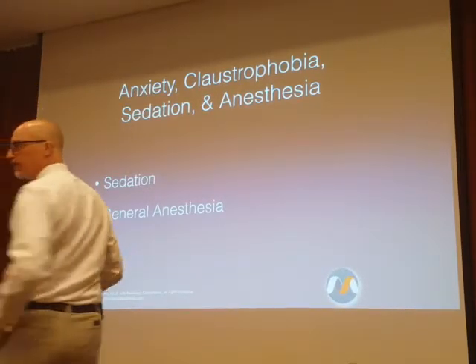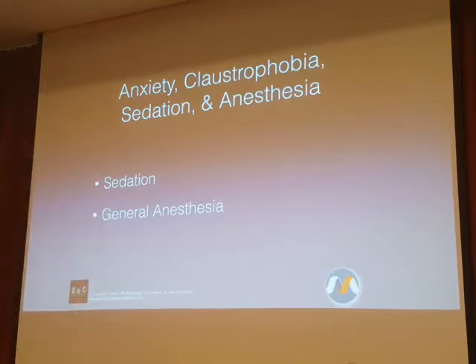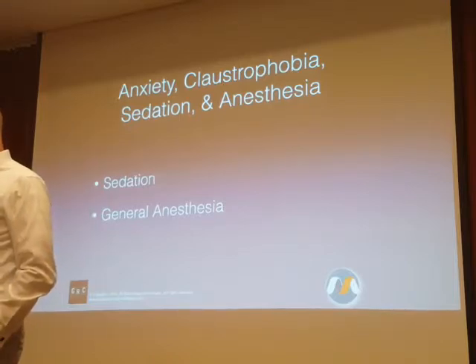Excuse me? Yes. I think at Medical City, there are 2 areas. There is a recovery area to sedate the patient. After that, we will push the patient inside the room. So all the machines for anesthesia are outside of the room, in the recovery room. So I think it's safer. It depends on whether the machine is compatible or not compatible.